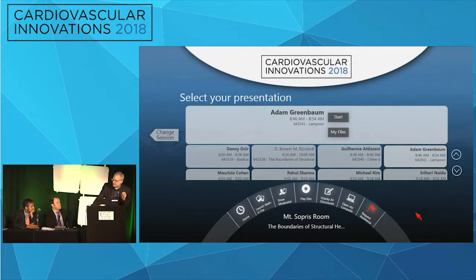So things I failed to mention for the procedures, we create an AV loop, right? So basically you go transseptal through the mitral valve and out the aortic valve and you grab it and you snare it. The reason for that AV loop is so you have a rail so that your retrograde catheter that has to go up in the LA for the snare, if it falls back, you can just easily go in and out. But what's key about that loop that you create is you need to be in the center of the mitral valve, not under any cords when you come out.